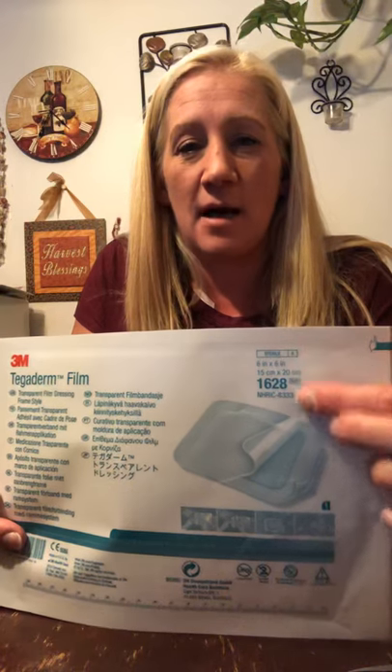Most of these supplies should be covered by your insurance, and there is one item that you just buy at your local grocery store. First of all, you're going to want to get the six by eight frame style Tegaderm. You want to make sure that it's the frame style — not just the regular kind, as that will make it more difficult.